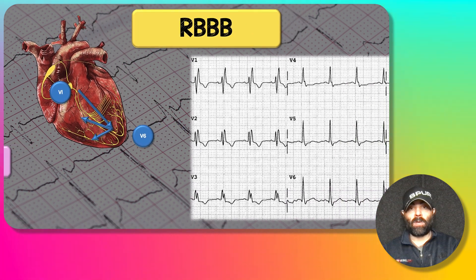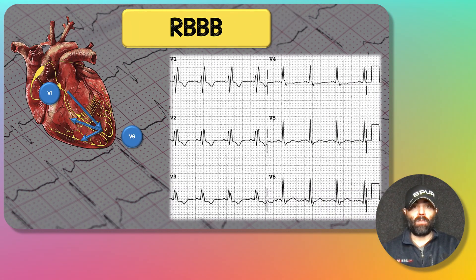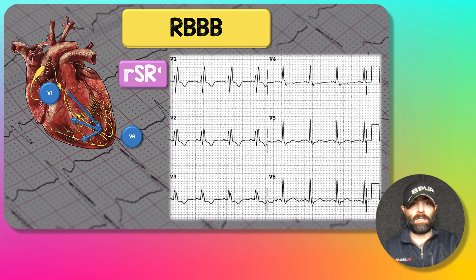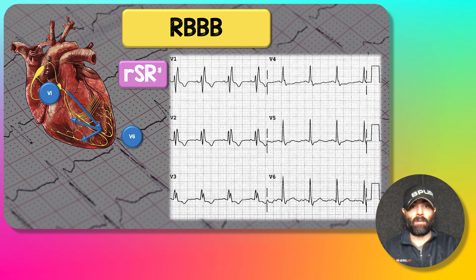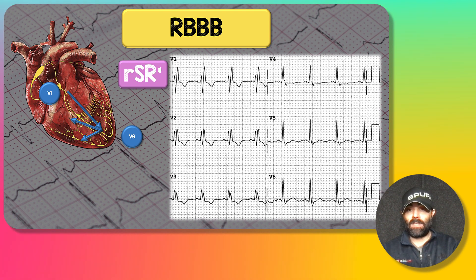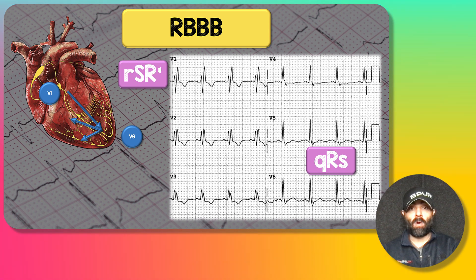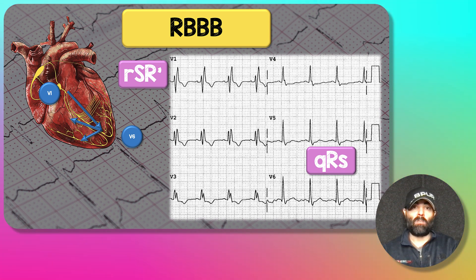Here are the precordial leads from someone with a right bundle branch block. You can see the RSR-prime pattern — depolarization initially going away from V1, then coming back across to the right giving the predominant R-wave, the rabbit ears pattern in V1. In V6, there's a big R-wave as depolarization moves toward V6, and then a slurred S-wave as depolarization moves back across to the right ventricle.